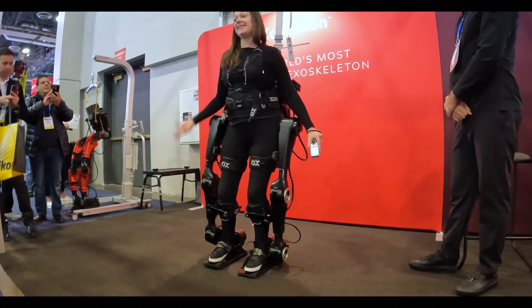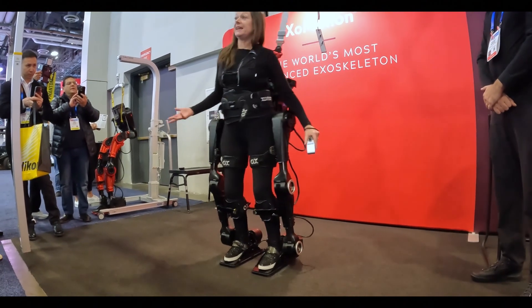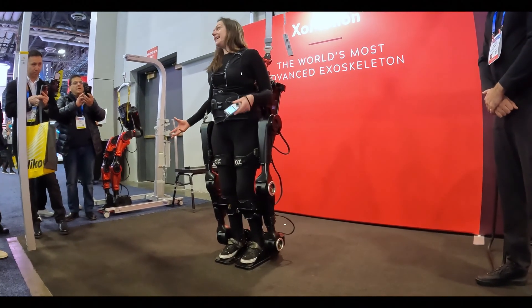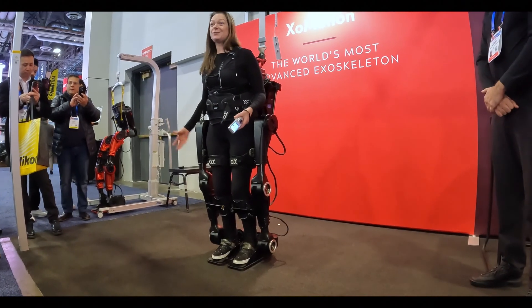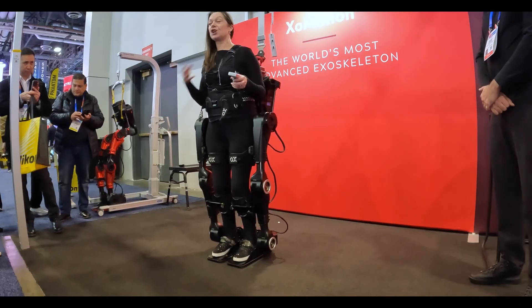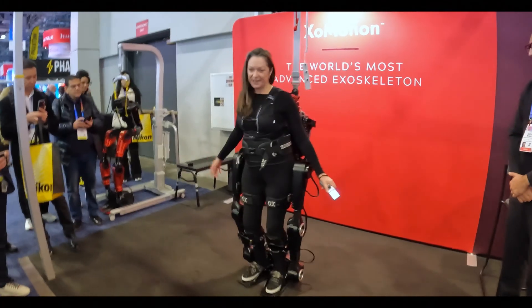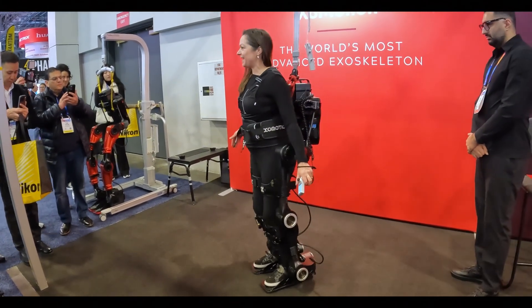Until today, this type of articulate natural motion after injuries such as spinal cord has never been possible. We're really excited to see the future of what research and rehabilitation is with devices such as ours. You'll also see it can turn in really articulate motion — turn to the right, it can turn in place — and that's where you're going to see that incredible motion through the hips.